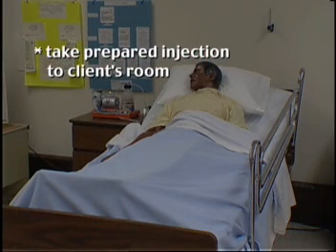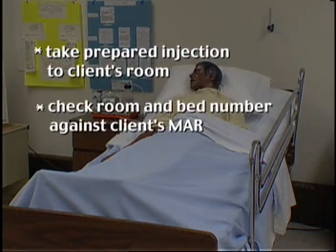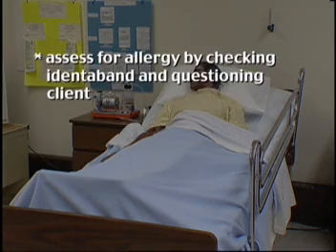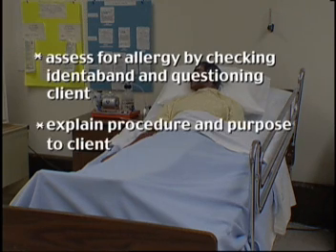Take prepared injection to client's room. Check room and bed number against client's MAR. Check client's identiband and ask client to state name. Assess for allergy by checking identiband and questioning client. Explain procedure and purpose to client.